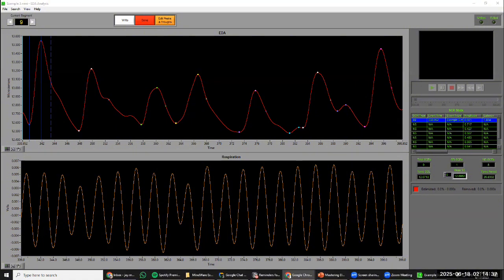Okay, so we have just a question of how to identify good skin conductance data. I hope that through the different things I've talked about since this was put in, it might help you a little bit more on identifying those. But looking at the level changes, that's the first thing to look at, because there could be something like the actual application just auto scaling, zooming in and creating that issue that we looked at in example one. It can be that the jaggedness of the line, even after we've corrected for the sampling rate, can be indicative of something like a lot of motion artifact.